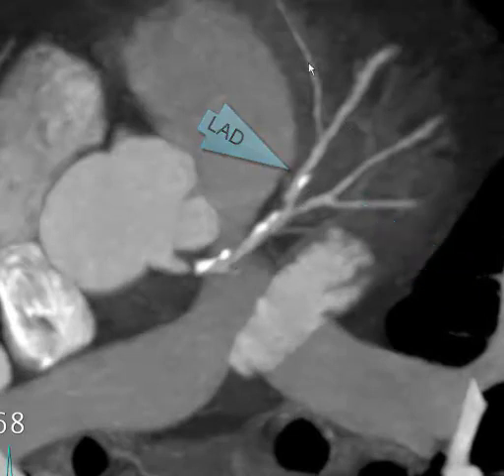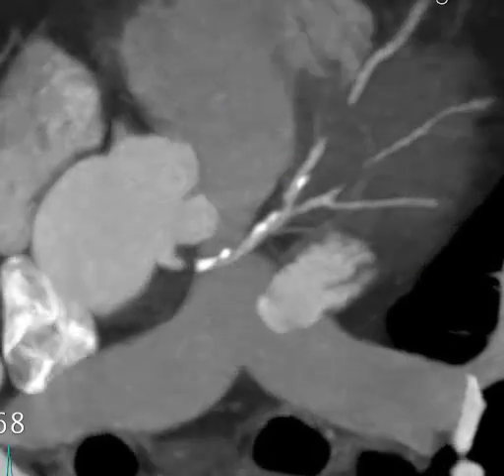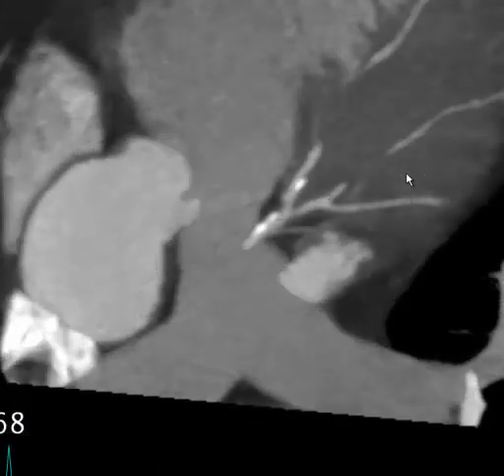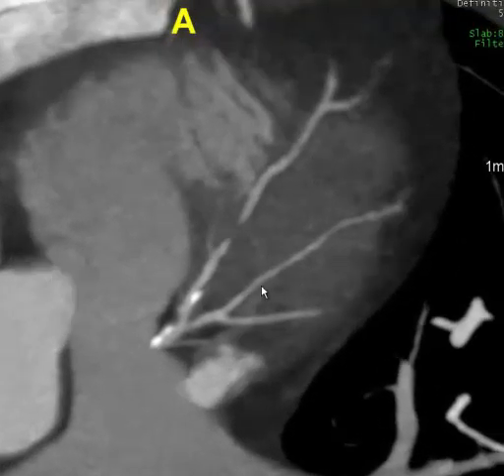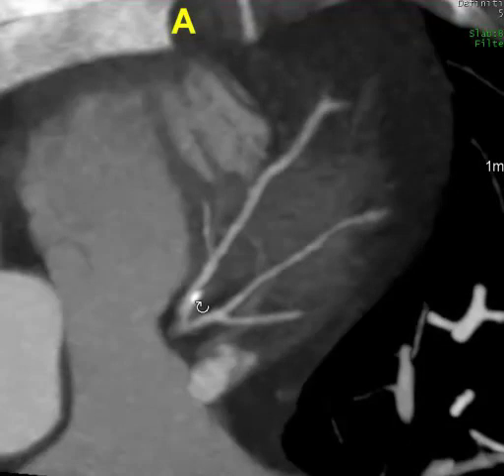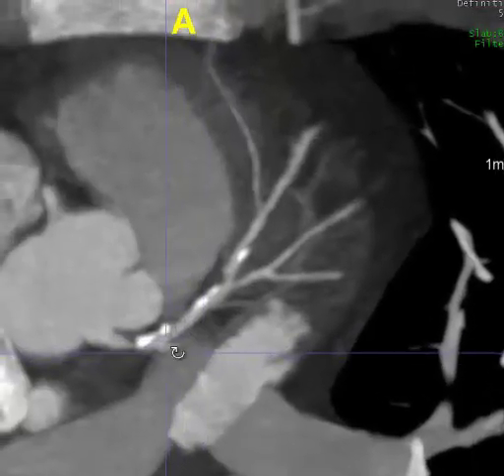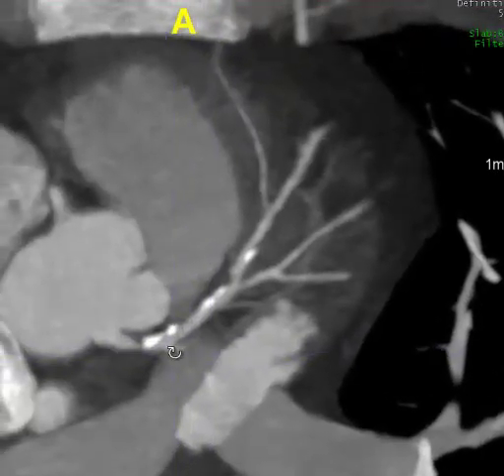Here's a large right ventricular marginal branch arising from the LAD, and again a large bifurcating diagonal vessel just here. No significant disease is noted of this element. However, as we go out further and further, we see that this is a large apical wraparound vessel.